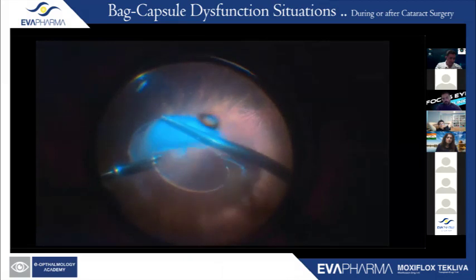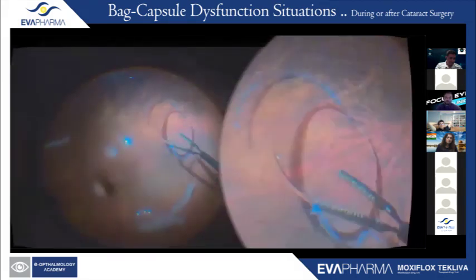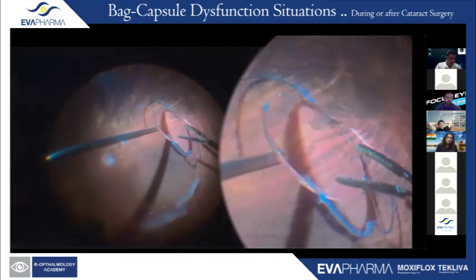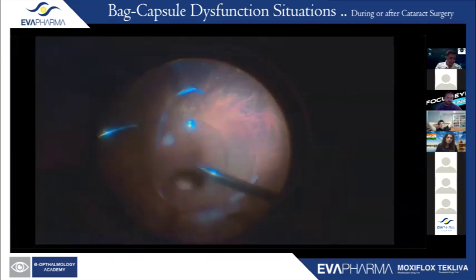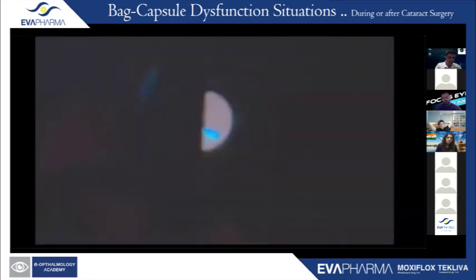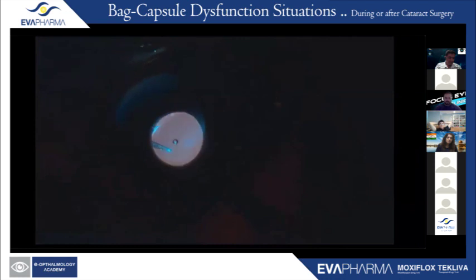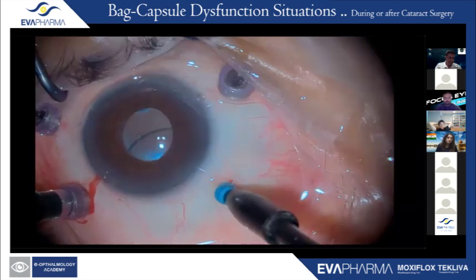Why? Because in elder patients, the endothelial cell count is physiologically already low, and I try to be as safe as possible for the cornea. So possible explantation procedure would damage the cornea additionally.